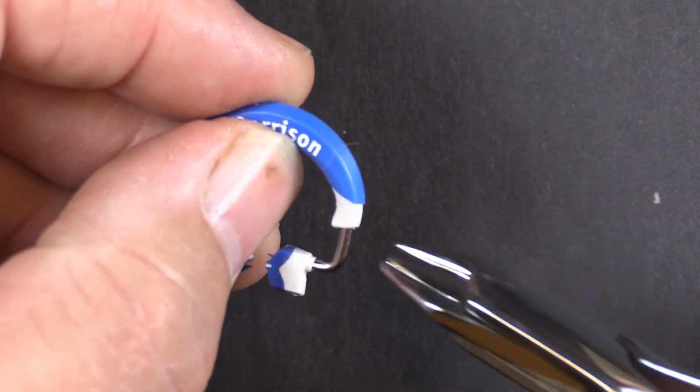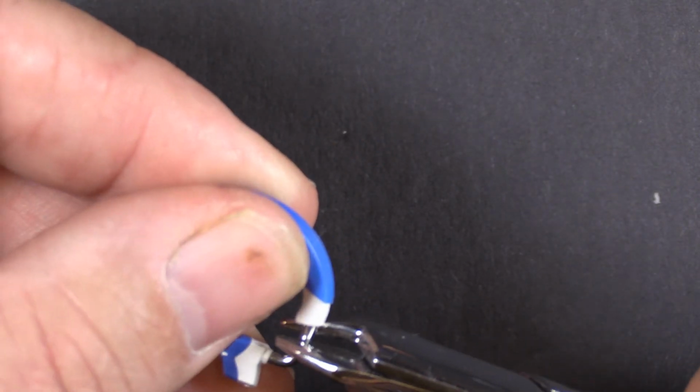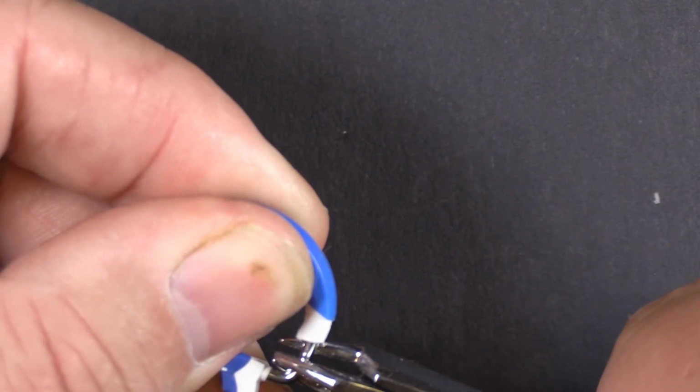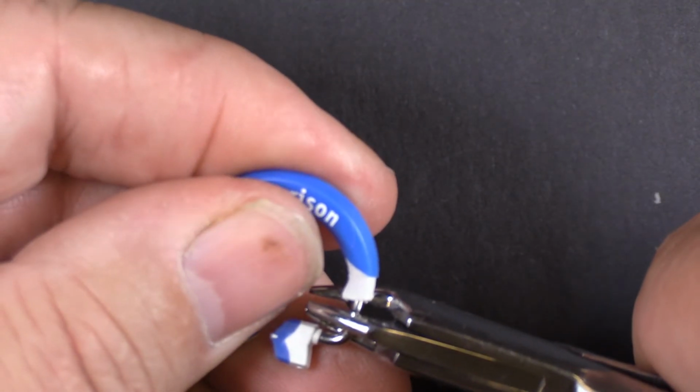Now you can, with that 3-prong plier, increase the angle. You've got to be really careful when you do this. You can see I'm starting to bend that up a little bit, just a little bit of flex on there.